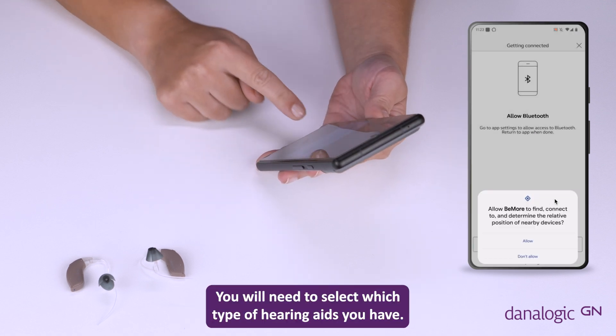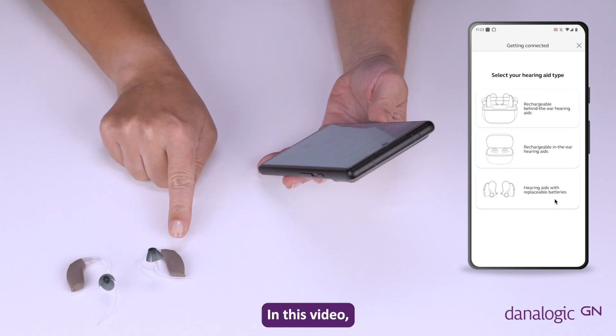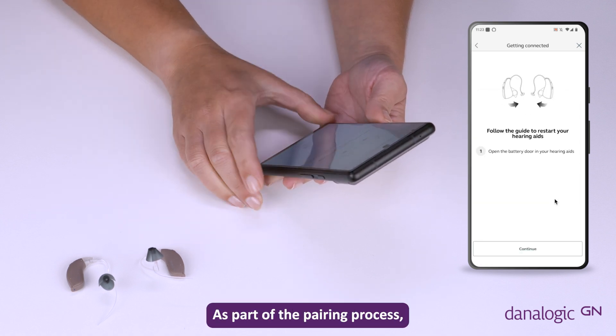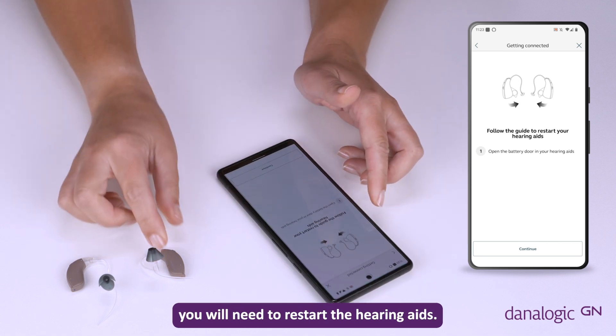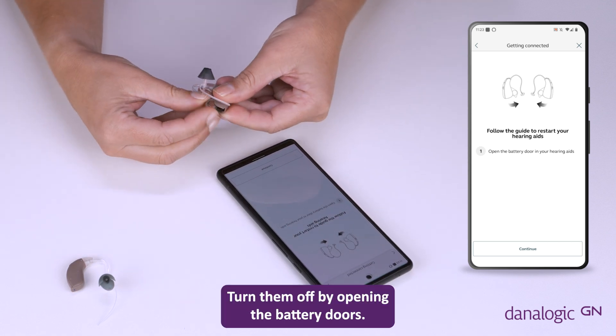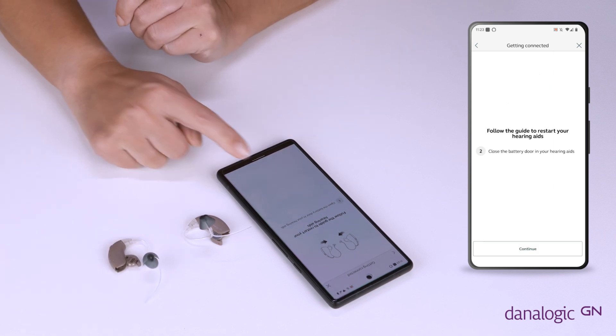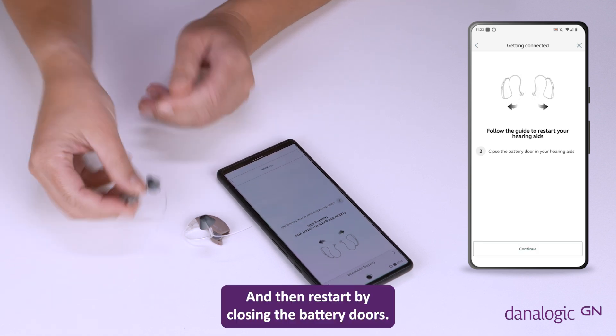You will need to select which type of hearing aids you have. In this video we are using hearing aids with replaceable batteries. As part of the pairing process you will need to restart the hearing aids. Turn them off by opening the battery doors and then restart by closing the battery doors.